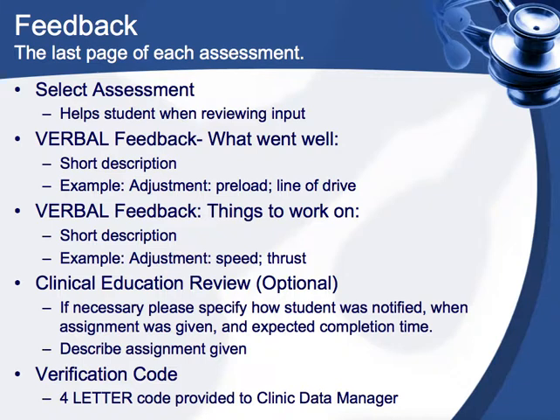Lastly, you'll do clinical education review if required. If any film is of non-diagnostic quality, you will need to assign clinical education review. In most X-ray positioning cases, this will be the assignment of another graded X-ray view. After that's completed, type your 4-letter verification code that only you and the clinic data manager know.